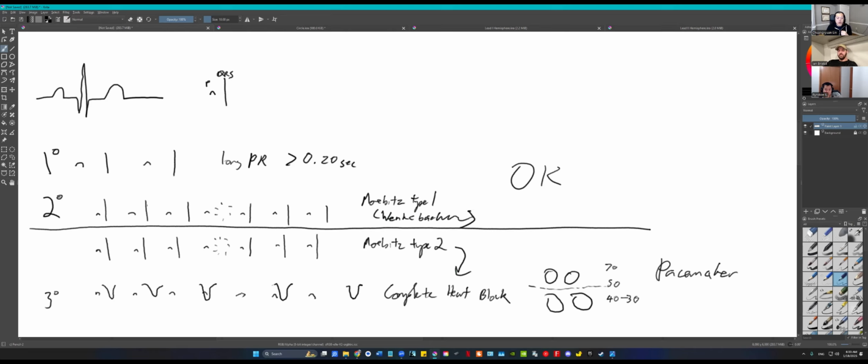And the way I rationalize this is, the AV node is misbehaving. There's a lag, there's a lag, there's a lag, and it just occasionally drops a beat, but it goes right back. Here, things conduct, and it gets swallowed up. Something just disappears. And just like China making people disappear, this is dangerous.